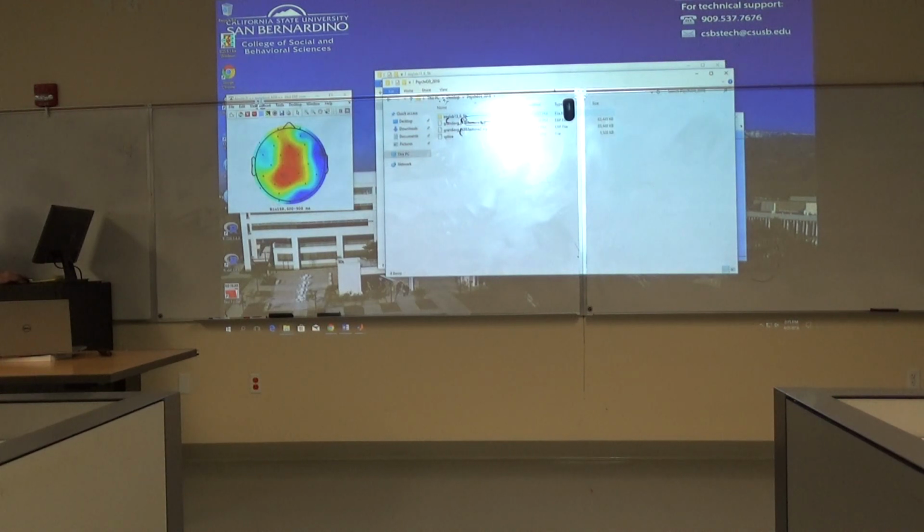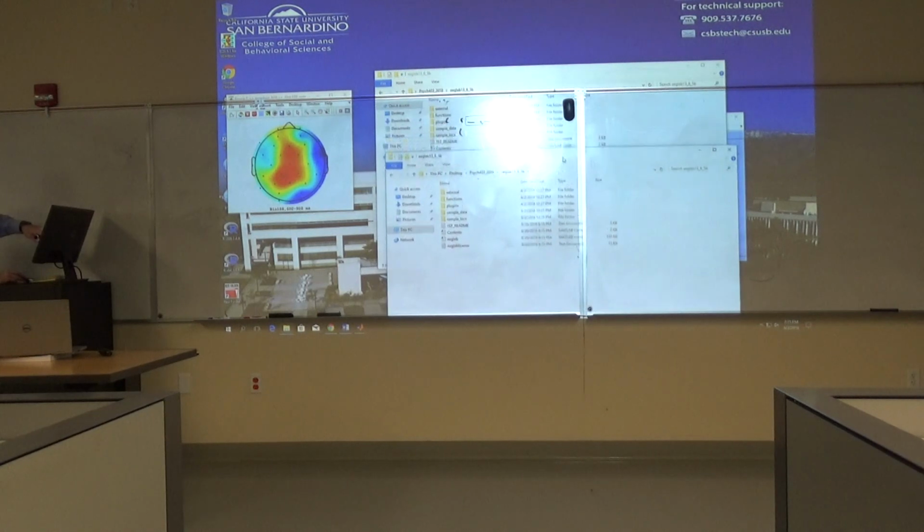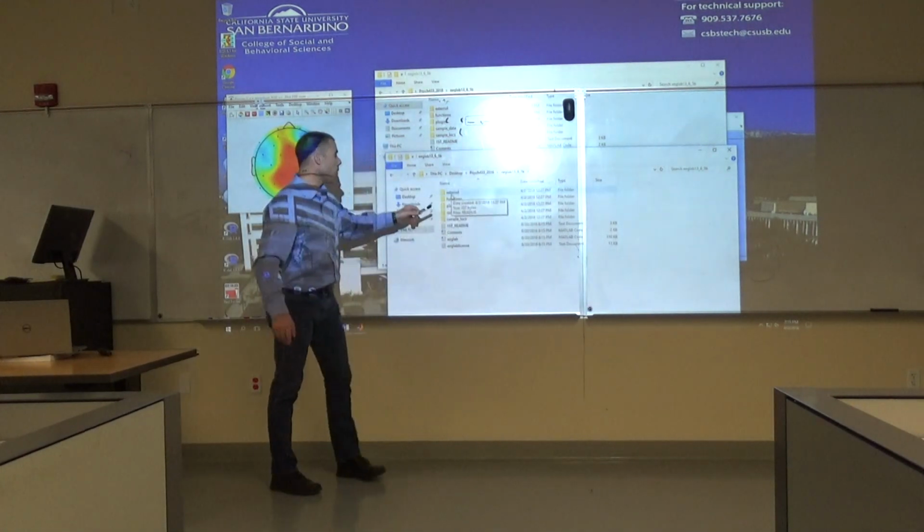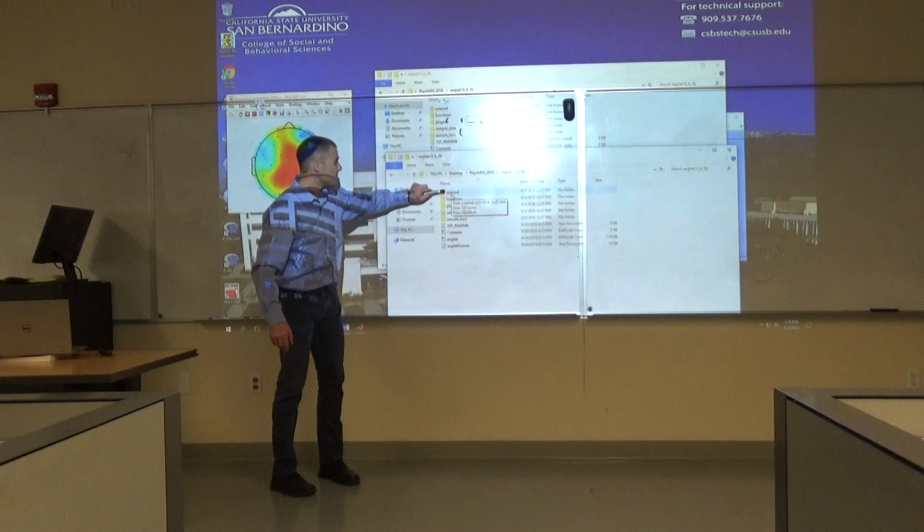So I knew from Alex's troubleshooting of it where that file lived. Okay, so what I'm going to do is navigate to that file, and it's in our EEG lab folder. See, I went to desktop, then I clicked on our folder, then I clicked on EEG lab. See how it populated across? Now I'm going to click on this second folder down named functions.